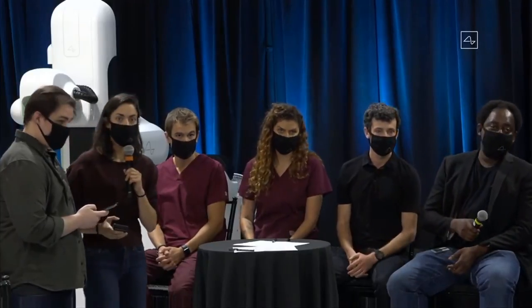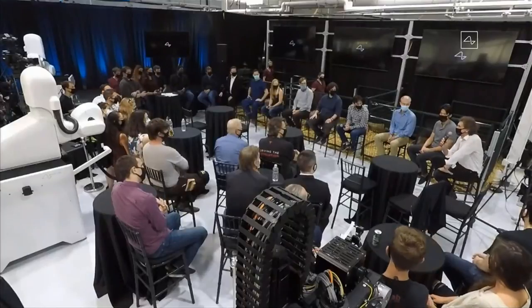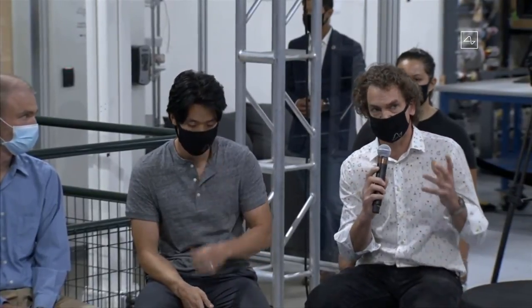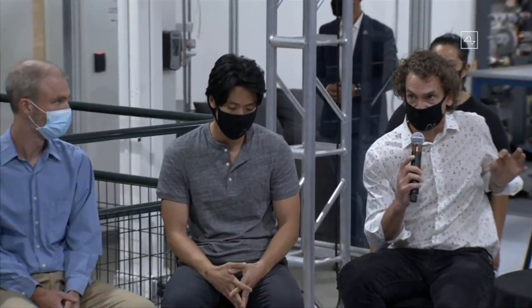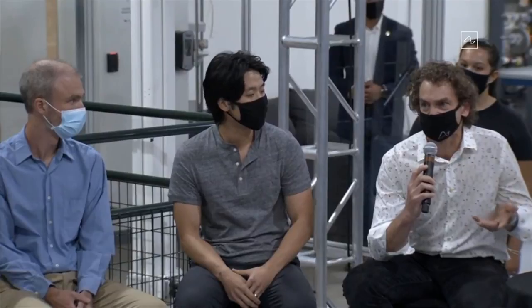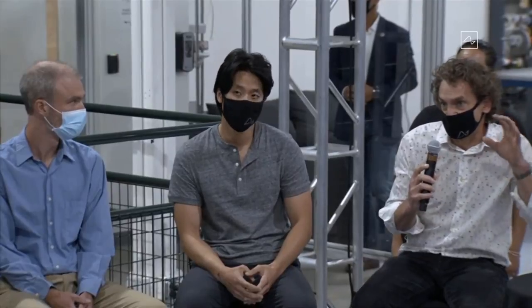Fantastic. Anyone else? Dan, do you have something to add? Yeah, I think one of the things that's allowed us to make such fast progress in the last few months is the use of pigs as a model. We started out choosing pigs because of the very similar anatomy of their skull to humans, same thickness and similar dural membrane. But as time went on, we realized that pigs have amazing other properties. You can train them to walk on treadmills. You can train them to do all kinds of tricks, and they have a large representation of the snout in the cortex, which you can very easily stimulate. So the question would be, why are we using pigs? I think we've even surprised ourselves at how useful they are as a model.